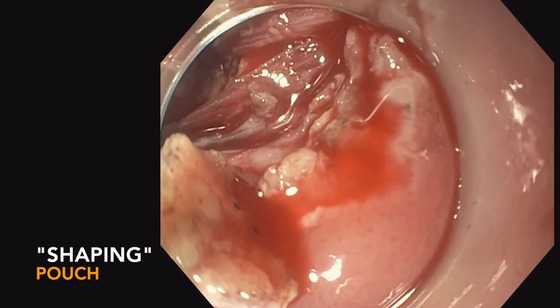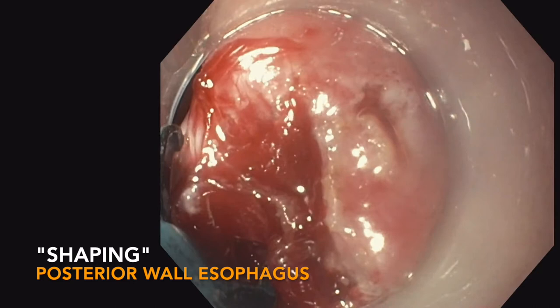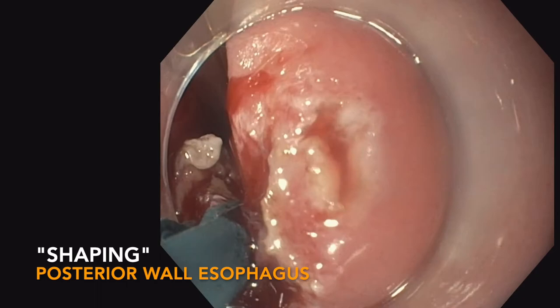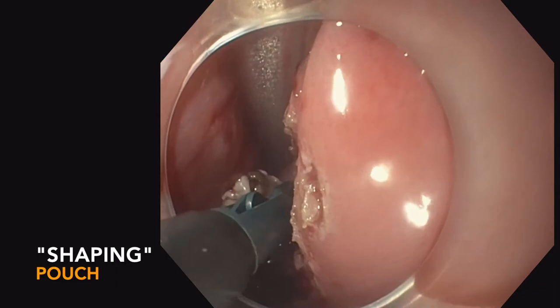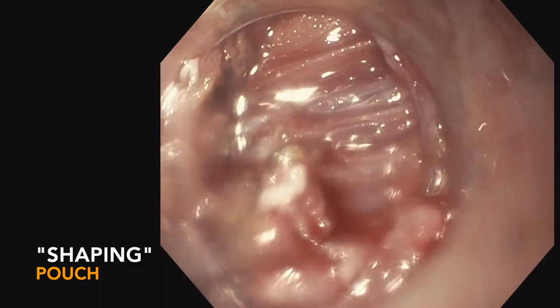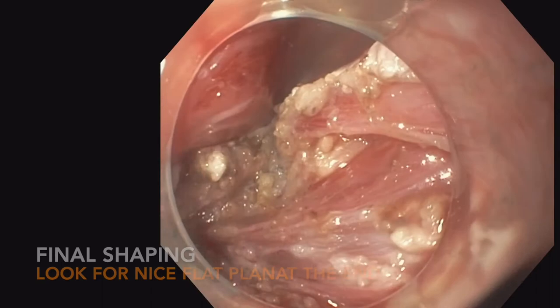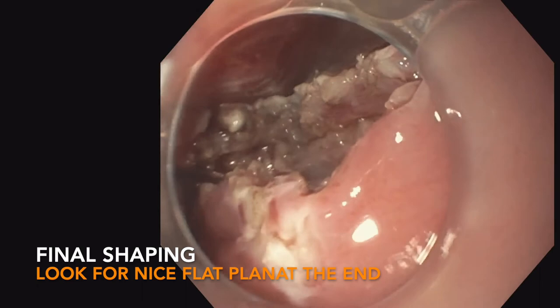After complete dissection of all of the cricopharyngeal muscle, we do additional shaping. In particular, it's important to dissect some of the posterior wall of the esophagus slightly. This leads to decreased recurrences as well as potentially better alleviation of dysphagia. This has been shown in some of the ENT literature. Here you're seeing dissection along a portion of that posterior wall to completely flatten the pouch. A nice additional trick is shaping the pouch, which I've picked up from some of our ENT colleagues. Here you can see dissection of additional mucosa and submucosal tissue, allowing the pouch to be more flat. The resection of redundant tissue is also notable on your postoperative esophagram and may have long-term durable effects for the patient. Here you can see the post-resection area, nicely flattened out.